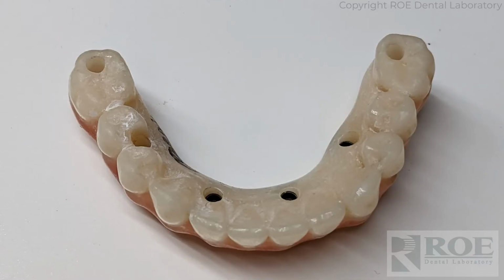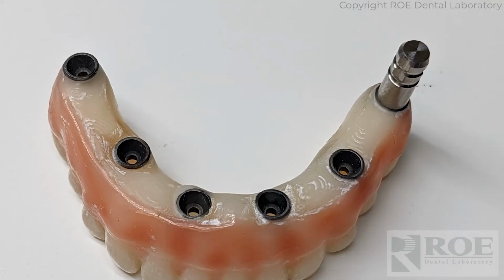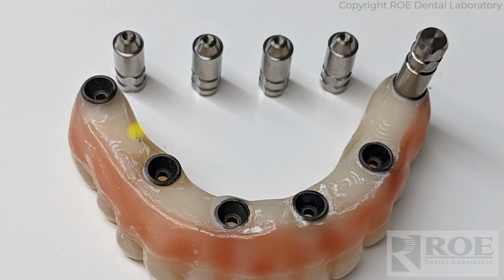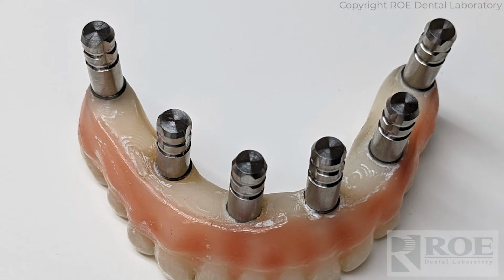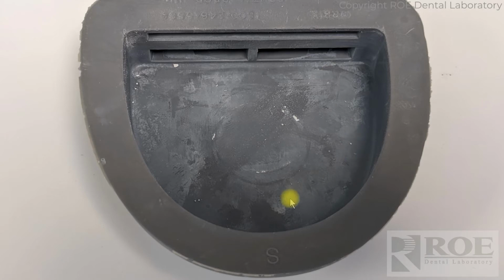With the prosthetic out of the mouth, I'll just show some different images here. But with it out of the mouth, add a multi-unit abutment analog, and you'll add one to each site so that now, just like any laboratory would fabricate, you're going to fabricate a model. So with this prosthetic, with all the analogs, find some type of flask. This is an actual laboratory flask, but it could be a denture cup. It could be any material that will hold a small vat of stone.